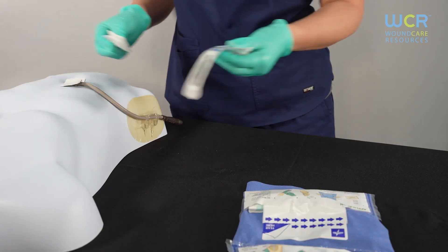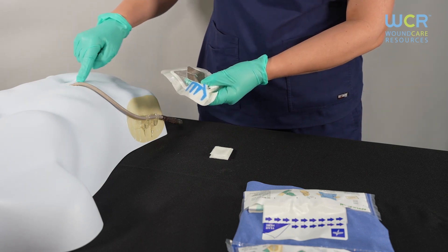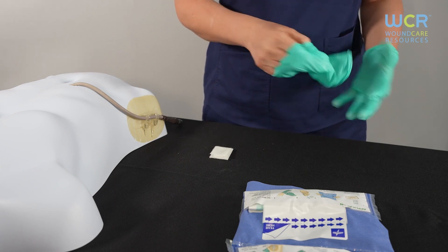Once the dressing is removed, check the insertion site for signs of infection such as redness, irritation, soreness, or drainage. Throw out the dirty dressing and gloves.